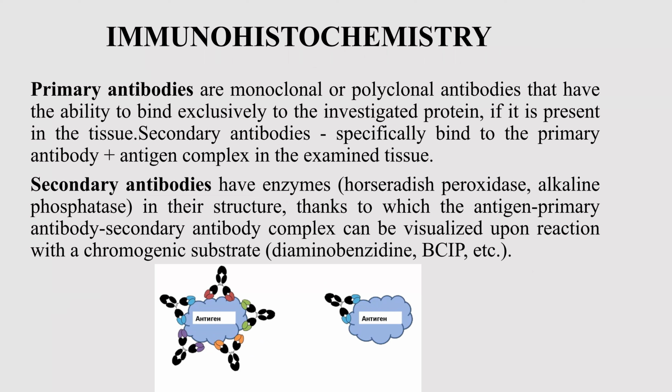The most widespread chromogen which helps us see this reaction is diaminobenzidine.